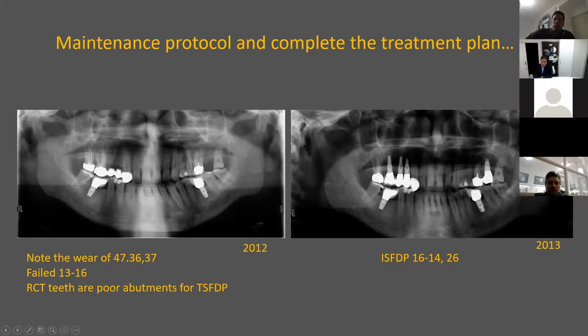For some reason, zirconia was placed. I wasn't around then, but zirconia was placed. He goes back and forth to Russia, and it's not about crown-based loading, okay, with time. I figured he might go back, and we won't see him for a long time. So we placed occlusal overlays because he was sensitive here. I didn't want the crowns, so there are occlusal overlays here.